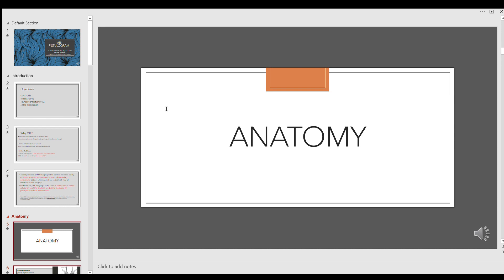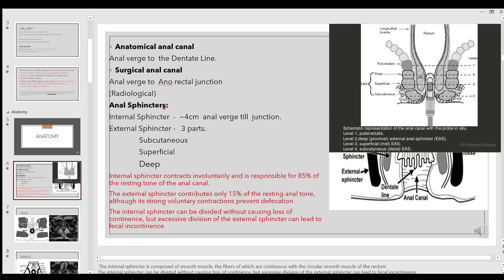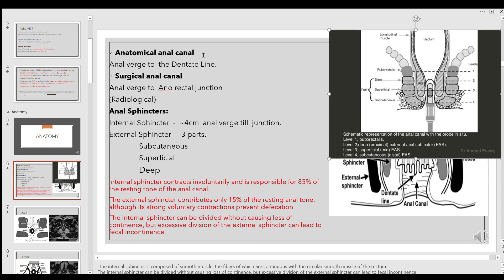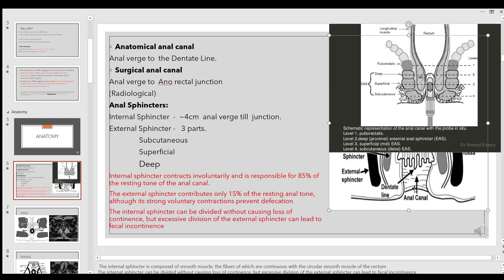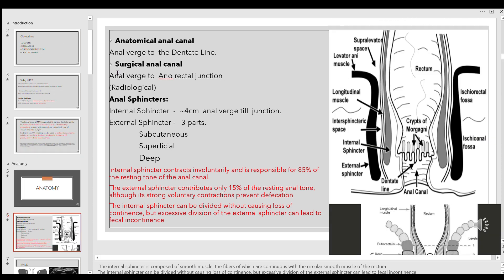Briefly on anatomy — two landmarks: the anatomical anal canal and the surgical anal canal. The anatomical anal canal extends from the anal verge to the dentate line. We measure from the anal verge to the anorectal junction, which is a little bit superior to that.